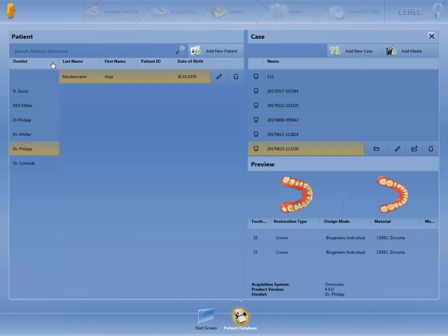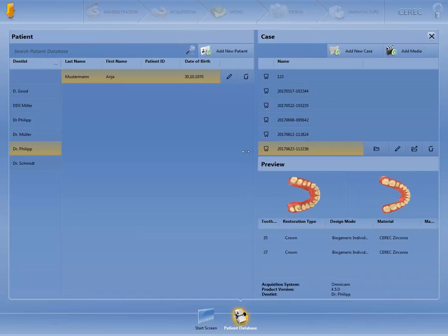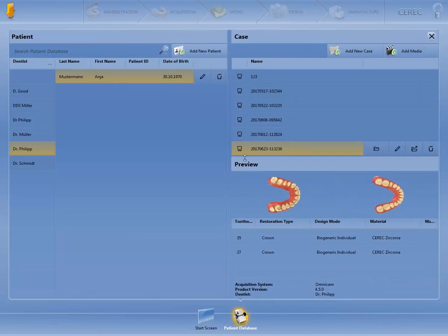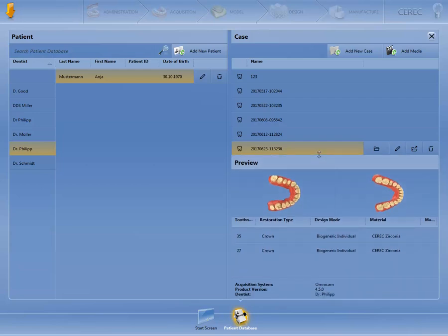You can maximize or minimize the fields. The fields can also be rearranged if necessary. For this, you need to click on the corresponding field, keep the left mouse button pressed down, and drag it to the desired position.